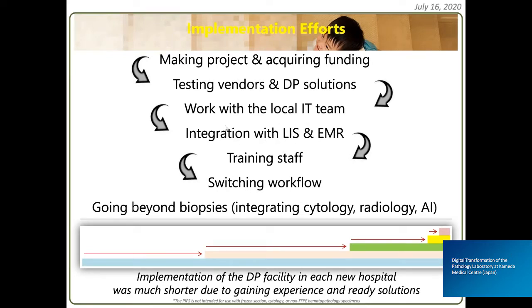Of course, there is the training of staff and convincing staff to work, and finally switching the workflow and going beyond biopsies, such as integrating radiology, AI, and more, which I'm going to speak about later. Of note, each further step, as you can see from this timeline, was shorter due to gaining experience and ready solutions.